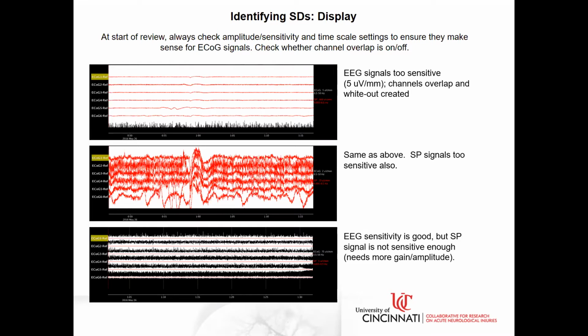The red traces, however, appear to be completely flat. They're just running through. So does that mean we're not getting any recordings in the low frequency range or what? No, it simply means that the sensitivity setting is in a bad range, and it needs more gain.